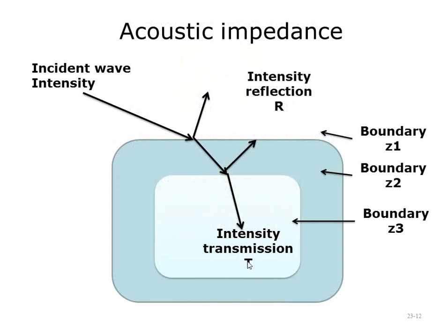To produce an ultrasound scan, we need many reflected ray interactions, many reflected intensities, and many transmitted intensities in order to get many two-dimensional images. So to produce the ultrasonic scan, we need reflection from several boundaries within the body.